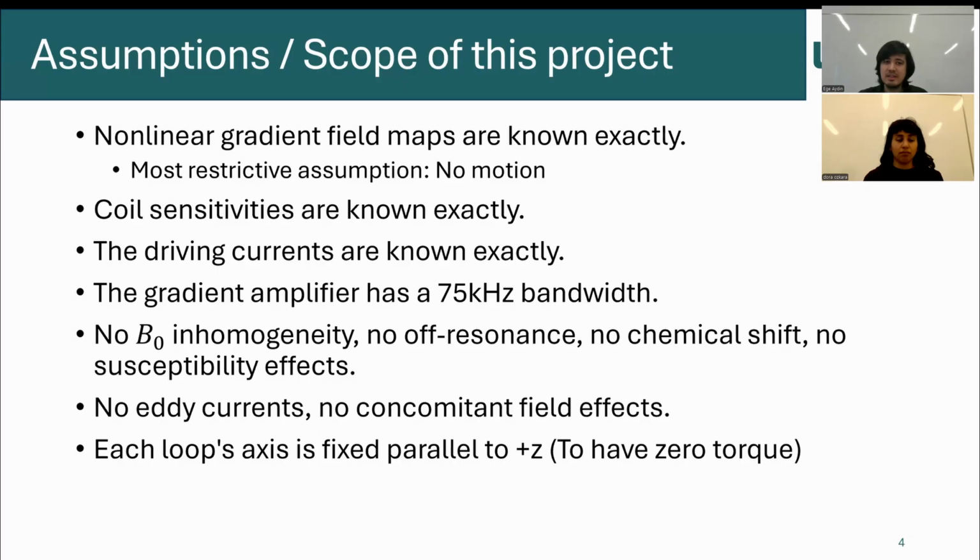We are not looking at any B0 inhomogeneity, off-resonance, chemical shifts or susceptibility effects. We are not looking at any eddy currents or concomitant field effects. And in our study, each loop's axis is fixed parallel to the z-axis to have zero torque.